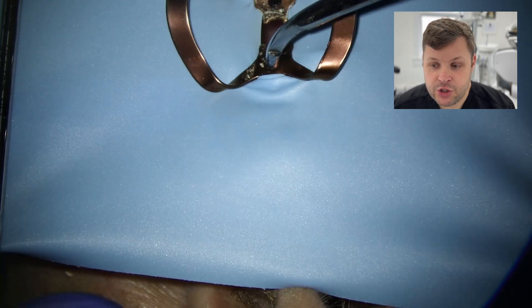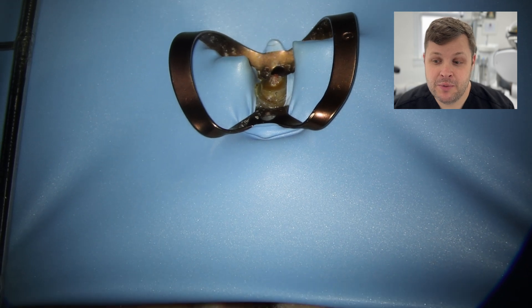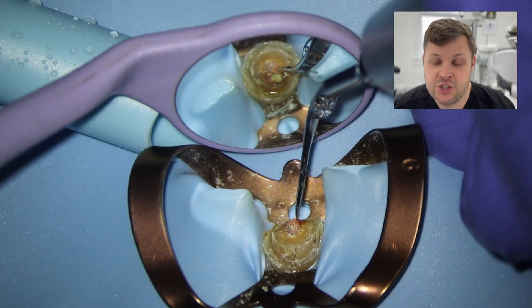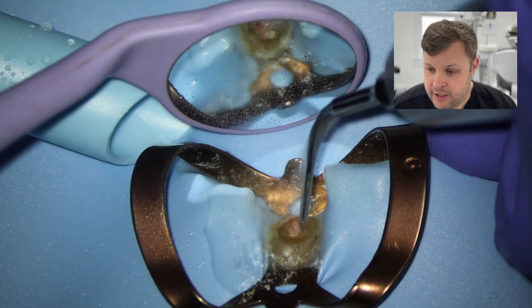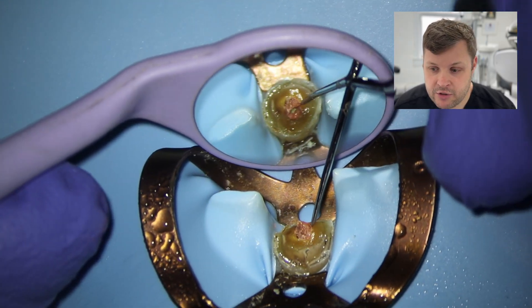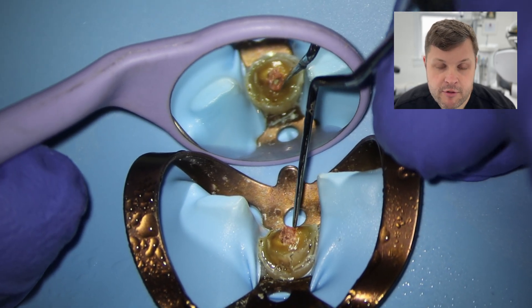Straight away we want to get the rubber dam on. You'll notice the tooth has already been root canaled — the referring dentist was worried they couldn't see the canal space, but it was actually just filled with GP. This GP is probably not as radio-opaque as GP we use now. It looks like a very old piece of GP, and I want to try and remove it in one piece — that's probably the most important thing here.